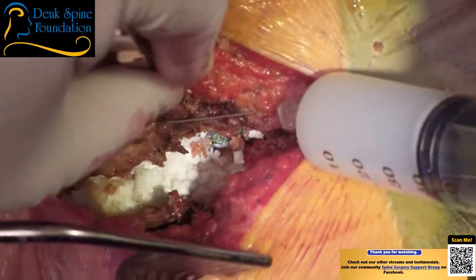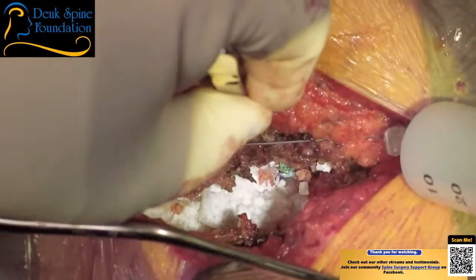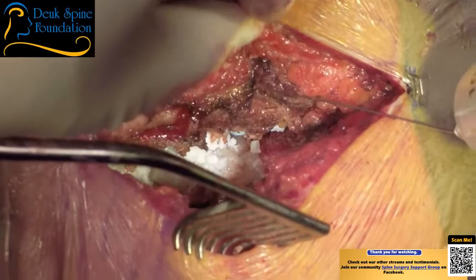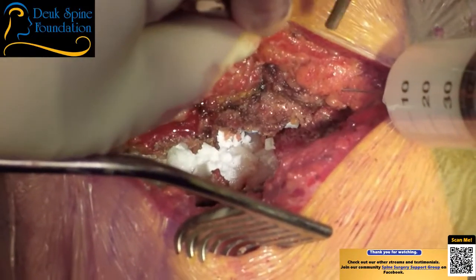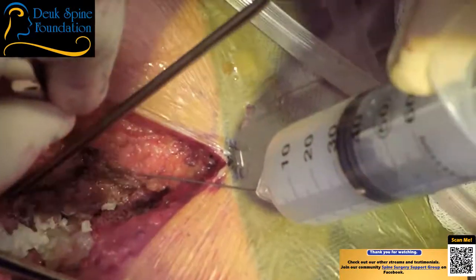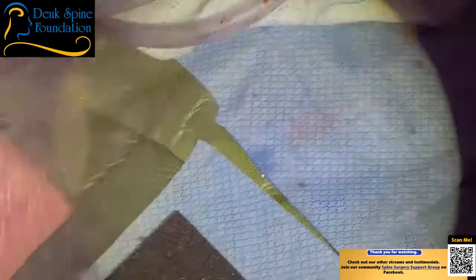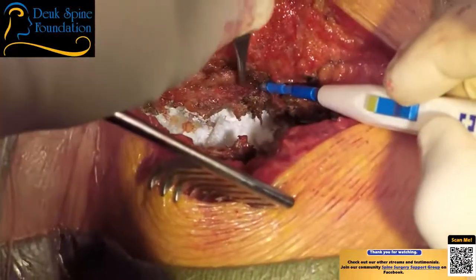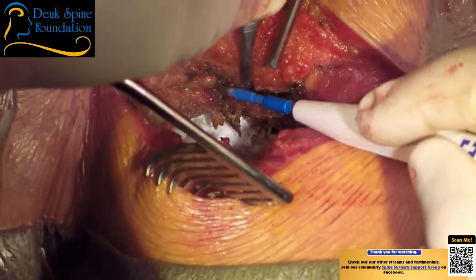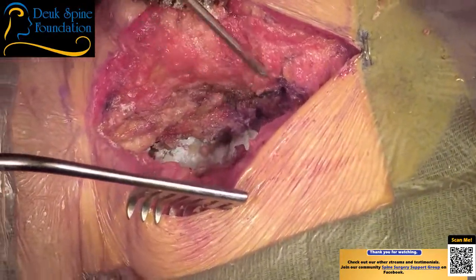So here I'm injecting Exparel into the paraspinous muscles. This is gonna make the paraspinous muscles feel better. I'm injecting Exparel, doctor. Okay. Of course I have to get bleeding with the injection. Let me have a Bovie. Yes, sir. Incredible. Just bad luck. Watch the needle. Okay. I've got my Bovie. We're going to find that little venous bleeder that I just created.